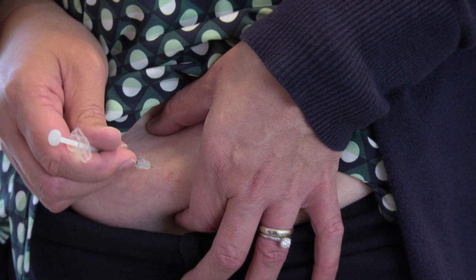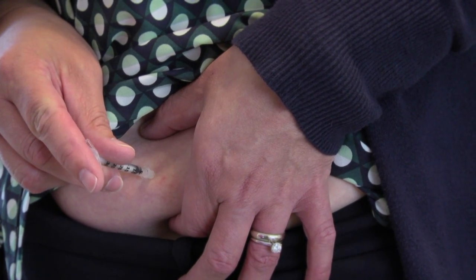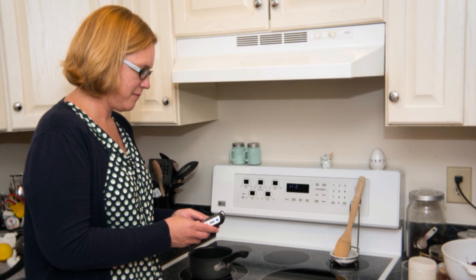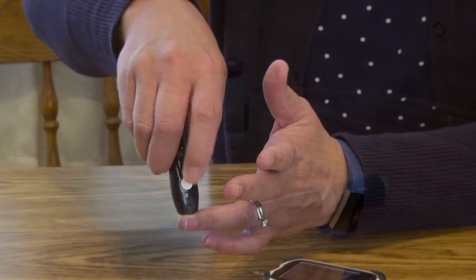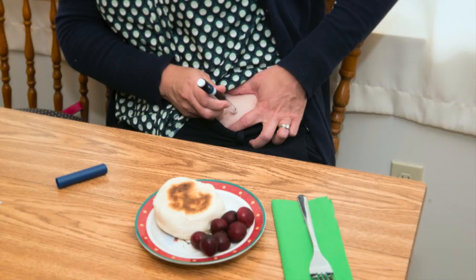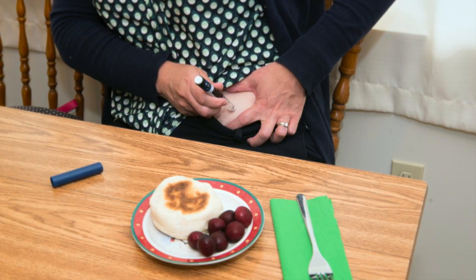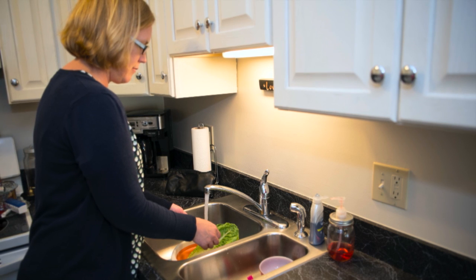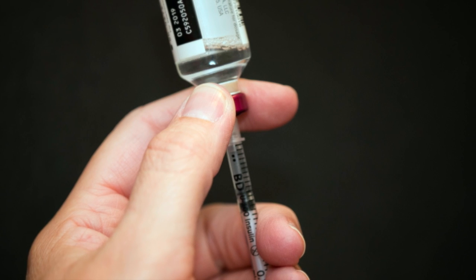You will begin taking insulin by injecting it with a needle into the subcutaneous tissue. To determine when you should inject insulin, pay attention to the times you check your blood sugar, when you eat, and what kind of insulin you are taking. Check your blood sugar no more than 30 minutes before you eat. If you are taking rapid-acting insulin before meals, give yourself the insulin when you sit down to eat. If you are taking regular insulin before meals, give yourself the insulin no more than 30 minutes before the meal.